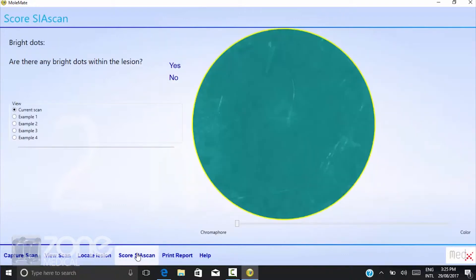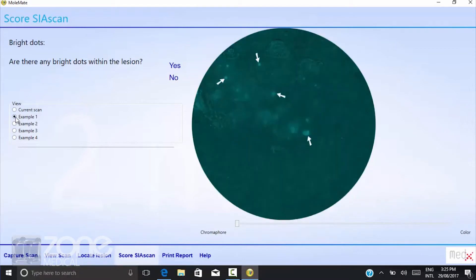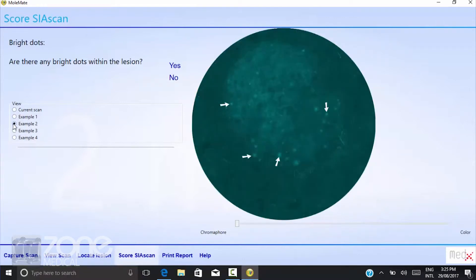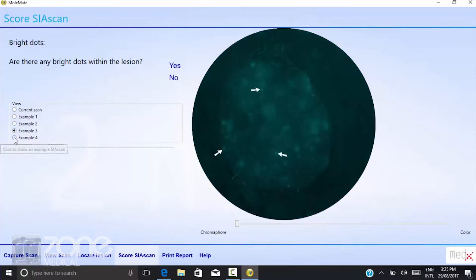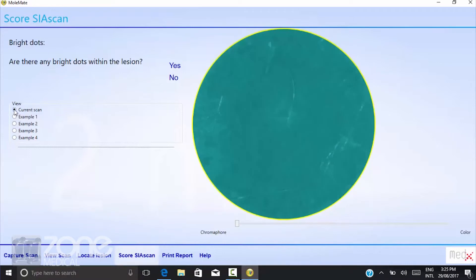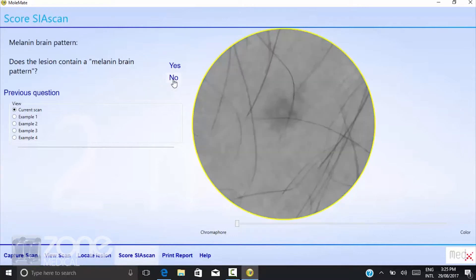You can then score the lesion. It will go through a series of questions — in this case, are there any bright dots within the lesion? You'll also see examples of what each question is referring to. Looking at the current scan, none of those appear to be bright dots, so we simply say no.